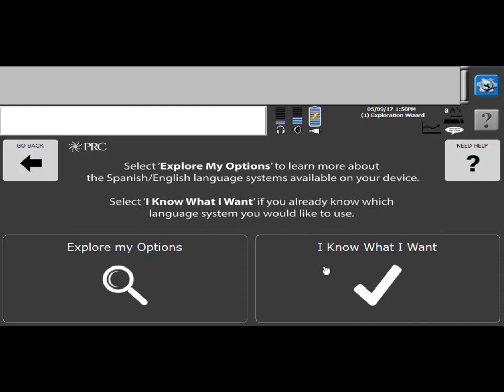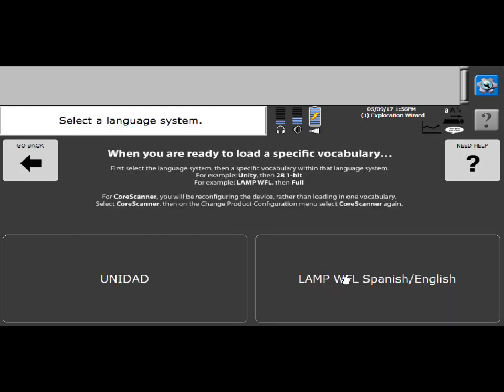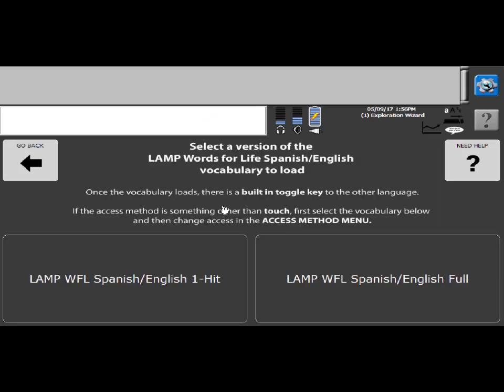So once you know what program you want, I'm going to say, I know what I want. And then you can pick either UNIDAD or Lamp Words for Life Spanish English. Today I'm going to show you Lamp Words for Life Spanish English, and you can load the one-hit or the full.